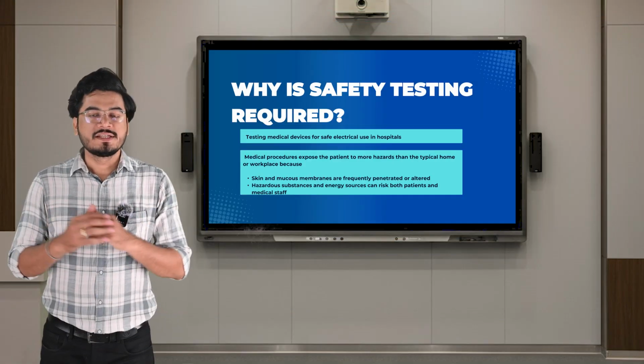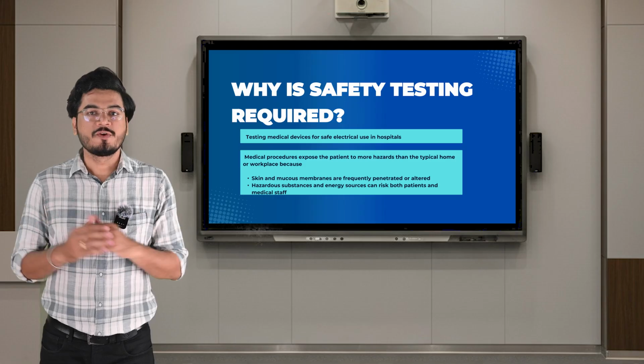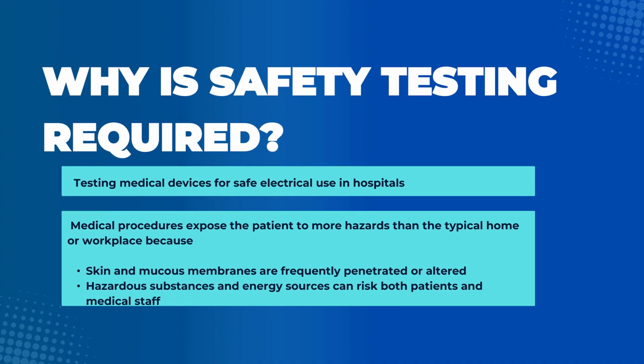So why is safety testing required? We test medical equipment to make sure it's safe to use in hospitals. Unlike homes, hospitals involve open wounds, tubes and invasive procedures. That means even a small fault in equipment could be very dangerous.